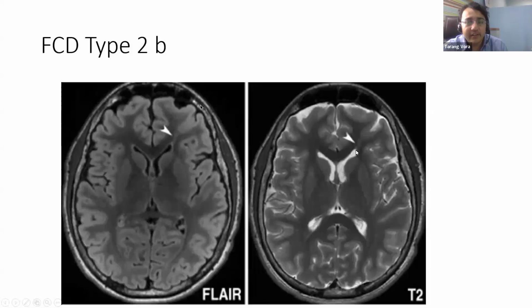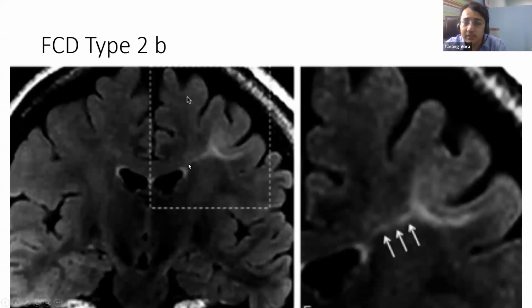We talk about the ventricle because the neurons migrate from the subependymal zone around the ventricles towards the cortex, and in this migration, when they are left behind and they have never reached the cerebral cortex, they leave behind a tract, and this tract is what we call the transmantle sign, which is common in FCD type 2B. This is a very good transmantle sign, which again is seen in FCD type 2B.